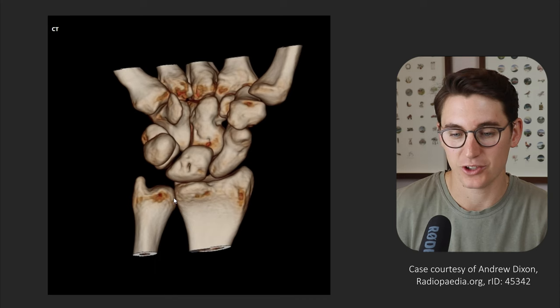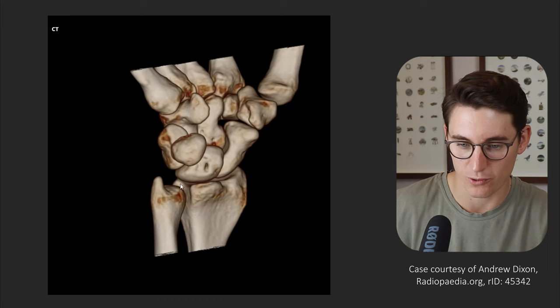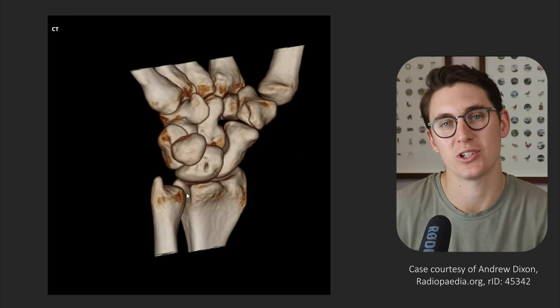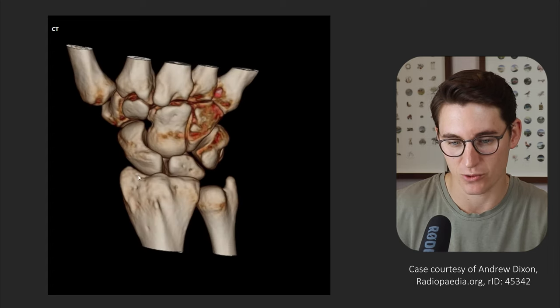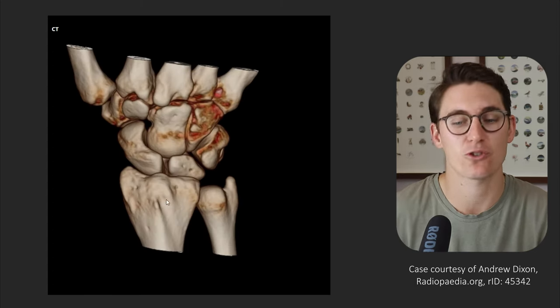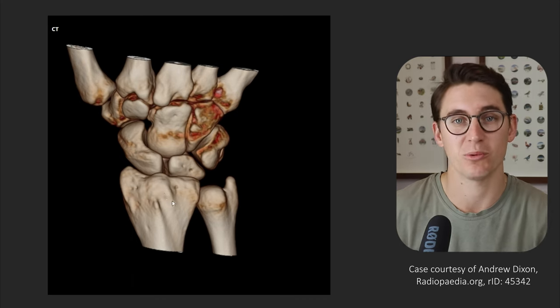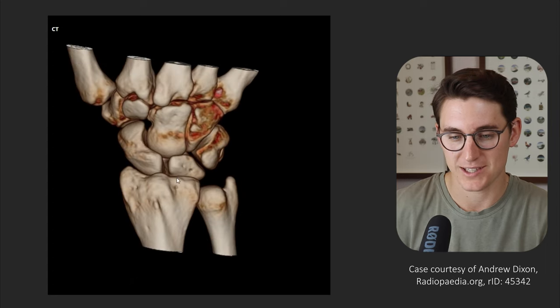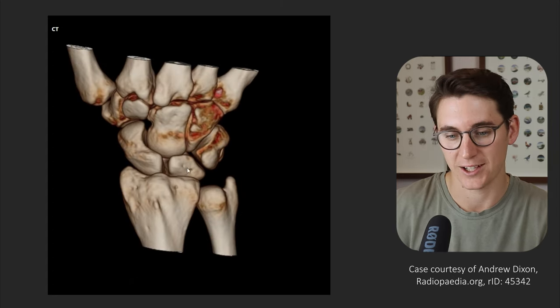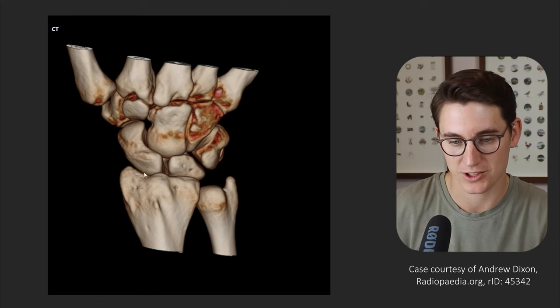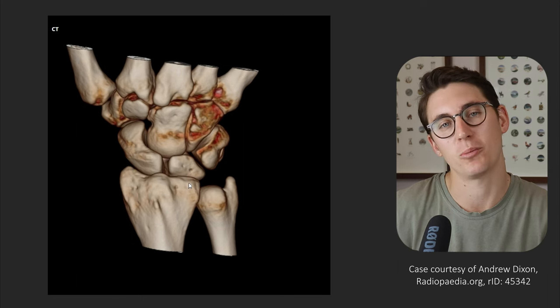Our radius and ulna articulate with one another at the distal radioulnar joint, and the groove in the radius is known as our sigmoid notch. Our radius has a radial styloid and also this bony outcropping known as Lister's tubercle, which is going to become really important when we look at the tendons of the wrist. The radius articulates with two carpal bones — our scaphoid and our lunate — forming the radial scaphoid joint and radial lunate joint, together called our radiocarpal joint.